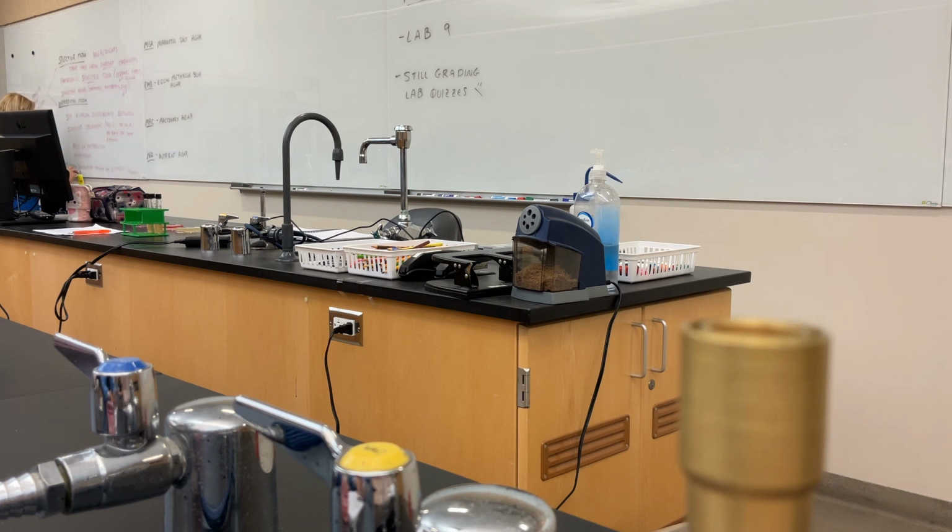And that's a key there, but not inhibit. Background flora. So the key for this one, where we use it a lot is with things like salmonella. Let's say I think a patient who's having stomach pains, upset stomach and diarrhea has a salmonella infection. So I will put their fecal sample in an enriched media.